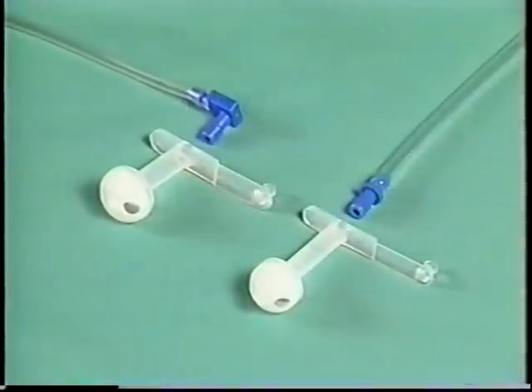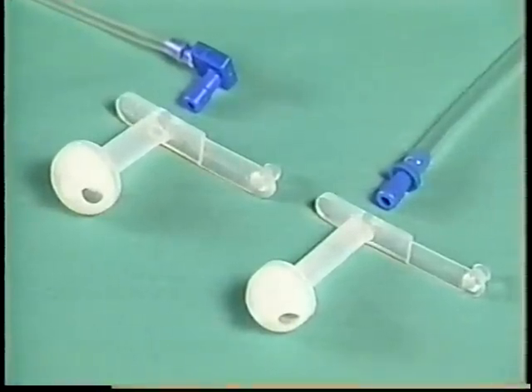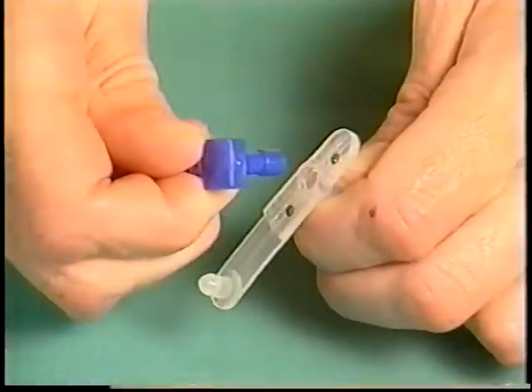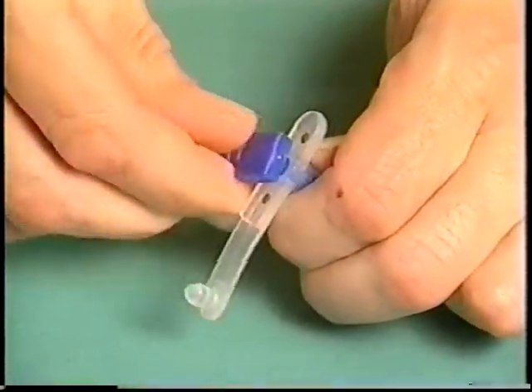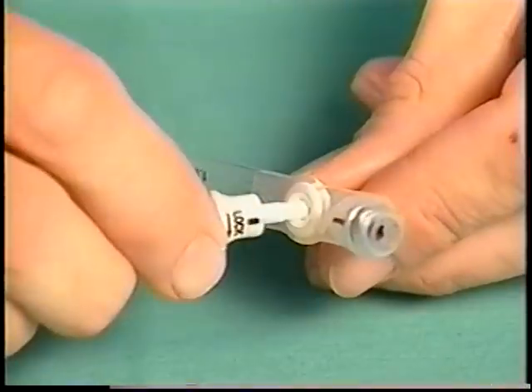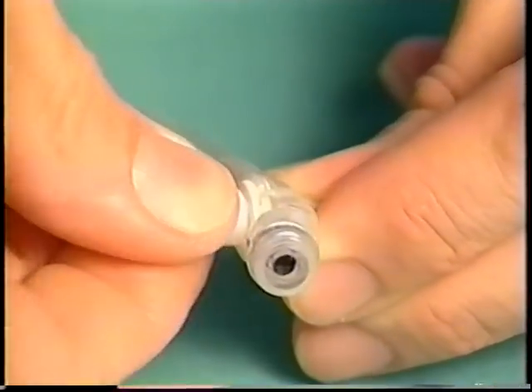If the patient has a low-profile button PEG, the anti-reflux valve in the device will prevent formula flow by gravity. Rather, the formula must be injected. To accomplish this, a bolus feeding adapter is connected to the device by stabilizing the button with both tabs and inserting the adapter. With some button PEGs, the adapter must be turned to secure it to the button.